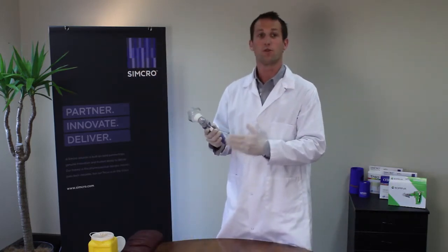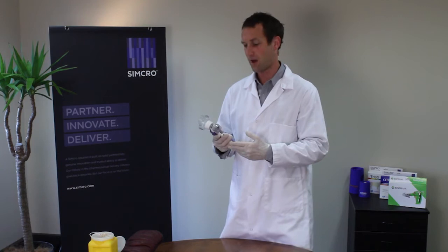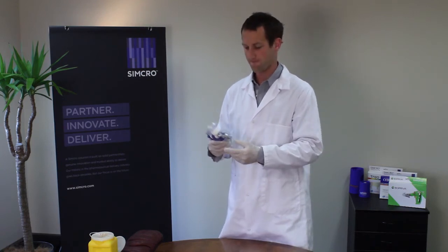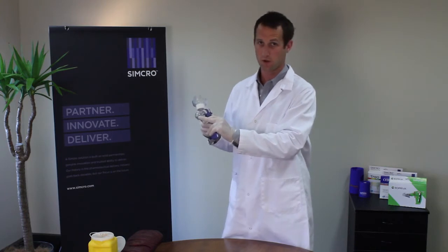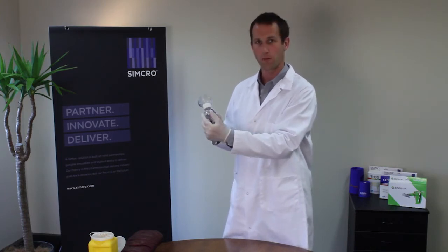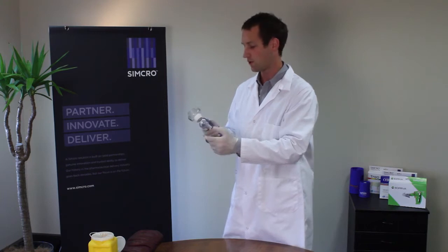Priming this injector also has its own technique. One of the key areas with priming is we don't use the needle when we're priming it, because we need to pull that needle guard back, which obviously exposes the needle.